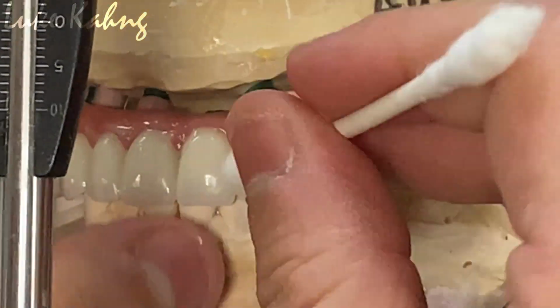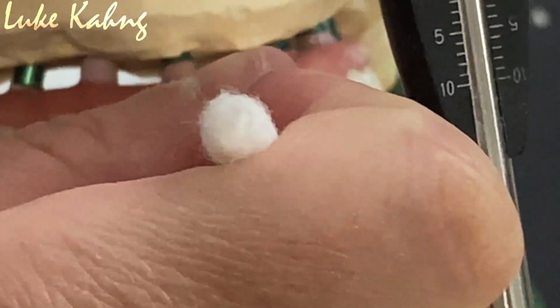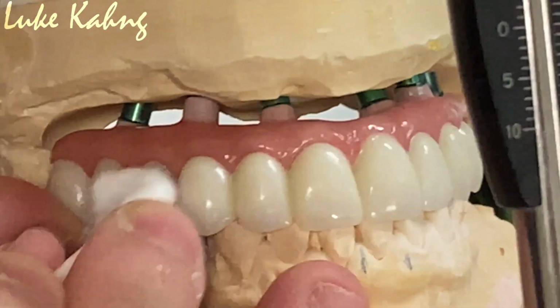The other side, same thing, and then we can do a light cure, and then a deep cure, probably 15 to 20 minutes as well. And then we can bond it together for the 7-star cases.